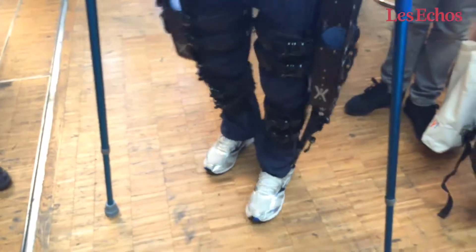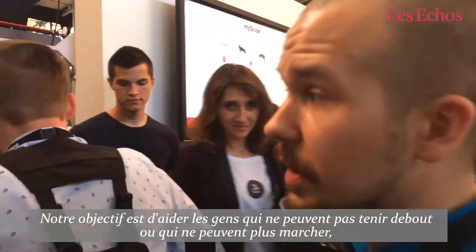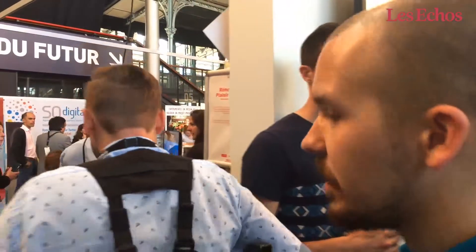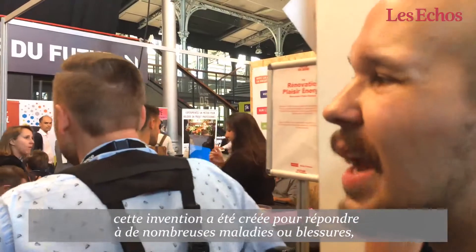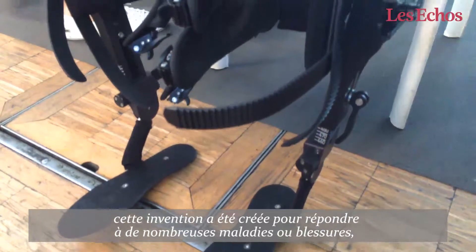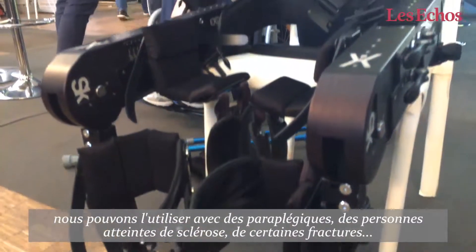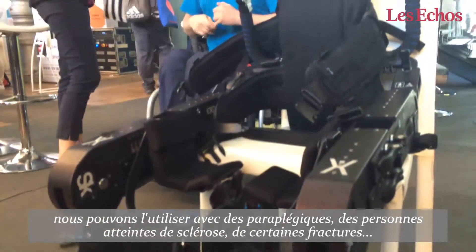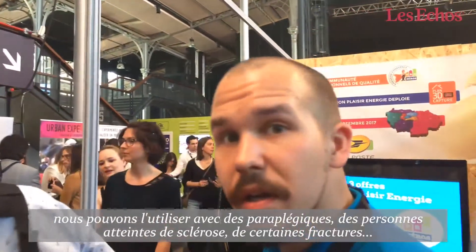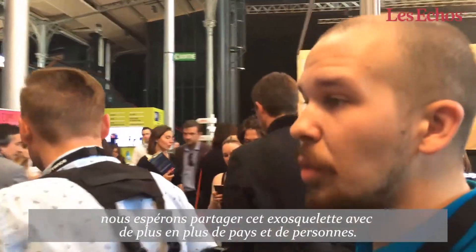The main goal is to help people that have problems to stand up and walk again. This rehabilitation device will help a lot of types of disease and injuries, because you can use it with paraplegics, with sclerosis and strokes, and many other types of disease.